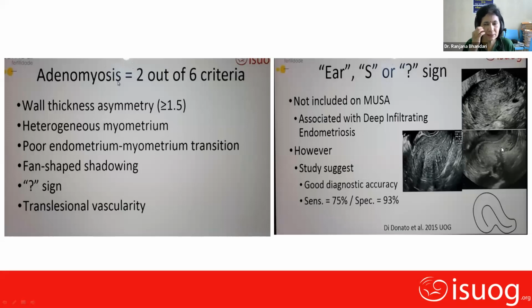Now, what do you mean by anteflexed and retroflexed? It is just the configuration between the cervix and the uterine body. See, this one is retroflexed. The whole fundus has gone posteriorly. So our cervix is anterior, but this one is posterior. Now you can see the cervix is anterior near the urinary bladder, but the fundus is posterior, near the rectum.